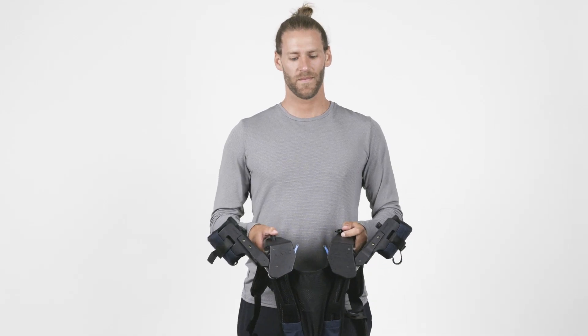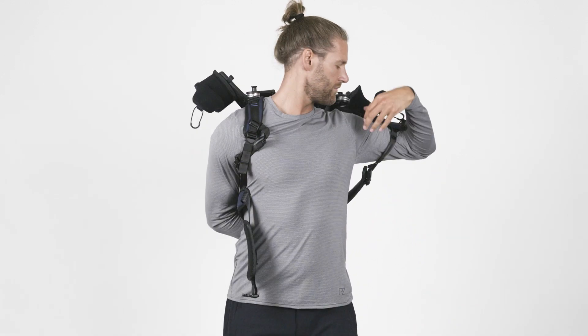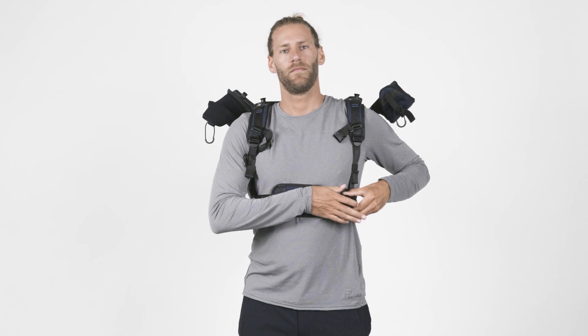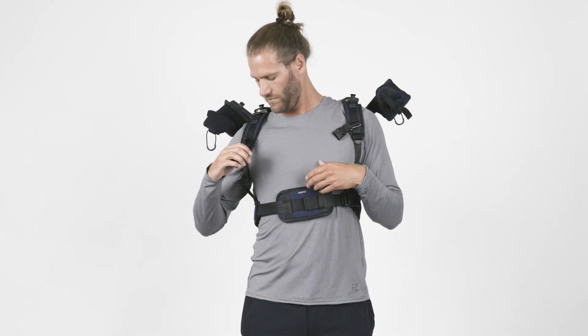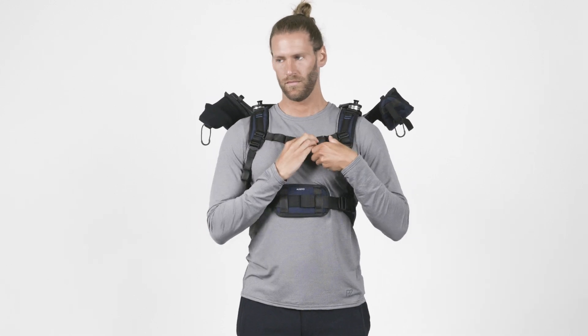Welcome to the DeltaSuit Quick Start Guide. This guide will help you quickly learn how to use the Auxivo DeltaSuit shoulder exoskeleton. Please familiarize yourself with the DeltaSuit and its functionality and usage to ensure you can fully take advantage of its numerous benefits.